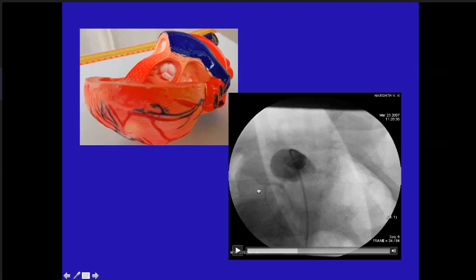Yeah. Now, this is okay. This caudal view, or laid back view, is okay for knowing the sinus origin of the coronary artery. But it doesn't serve much purpose for telling me about the distal coronary arteries, branches and all. It also doesn't help me in the arch. I don't see the arch at all. Why don't I see the arch?